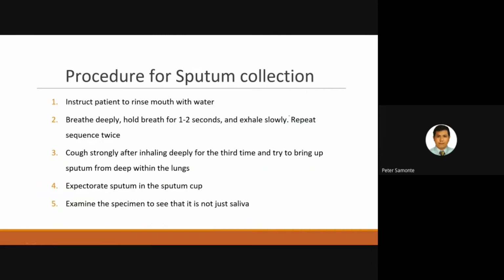So here's the procedure for your sputum collection. Instruct the patient to rinse the mouth with water. Breathe deeply, hold breath for 1 to 2 seconds, and exhale slowly. Repeat the sequence twice. Cough strongly after inhaling deeply for the third time and try to bring up the sputum from deep within the lungs. Expectorate the sputum in the sputum cup. Examine the specimen to see that it is not just saliva.